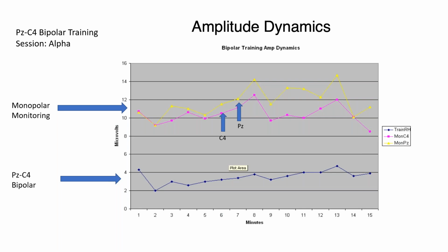If you had a coherence problem and you had too much high or low coherence, you might be able to shake up that stuck coherence, unstick it. You may be able to exercise coherence and phase and get changes. So there's a good chance that people found that bipolar training was quite effective. And the reason they called it the poor man's coherence training is because that's exactly what it was doing. Talking to the owner of Lexicor, you get a sense that he knew that. A few other people in neurofeedback actually understood that, and I think Joe Lubar did too, to some degree, but a lot of people didn't.